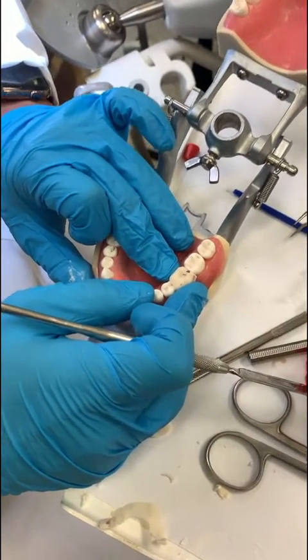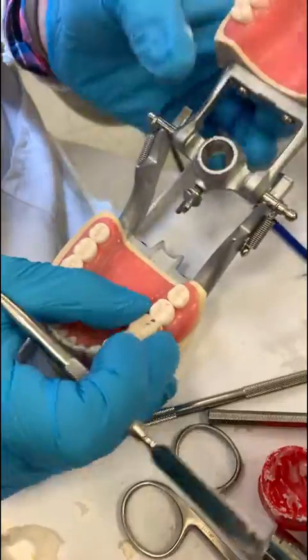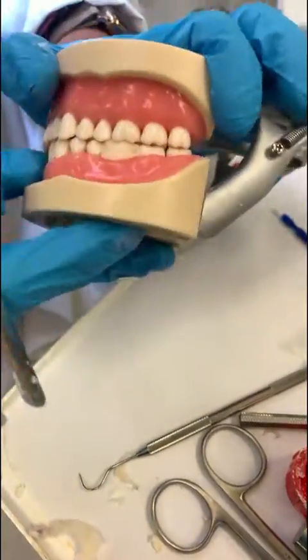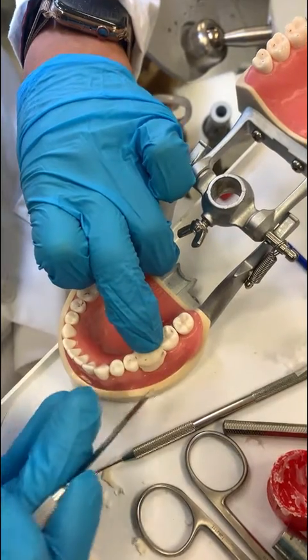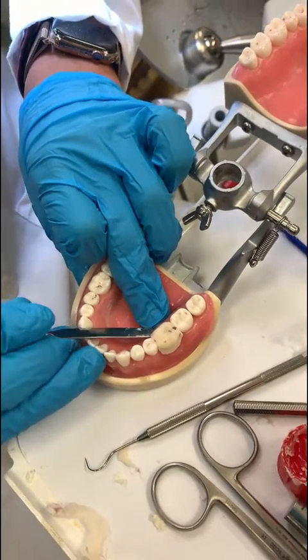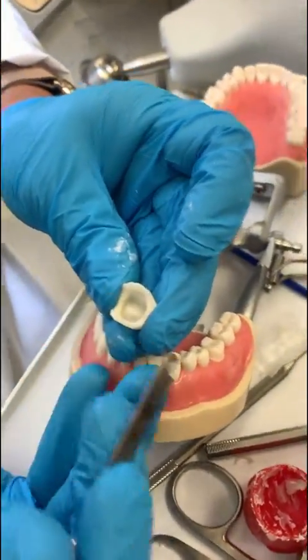We've got to press down buccal and lingual, then lift it up one last time and put it back in. Press down buccal and lingual again, have the patient bite down. The acrylic is already set. Done — lift it up for the last time. Now it's time to trim.